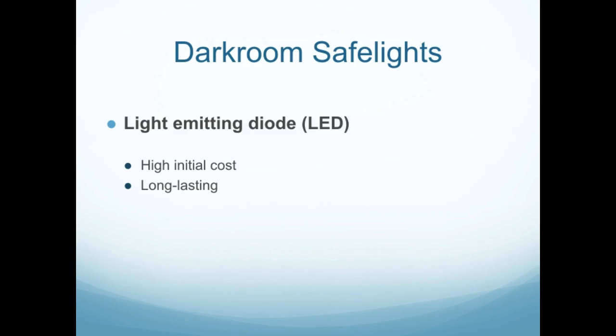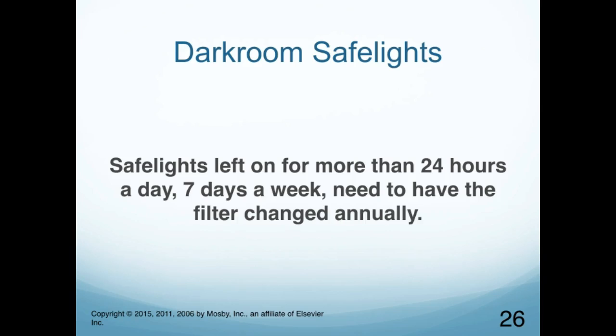And now we also have a light emitting diode, or LED, which again is just like the ones that we buy for our house. It has a high initial cost, but they will last a long time. Really what matters is the filter that they put over that. Usually it's the red filter, not so much the light source itself.